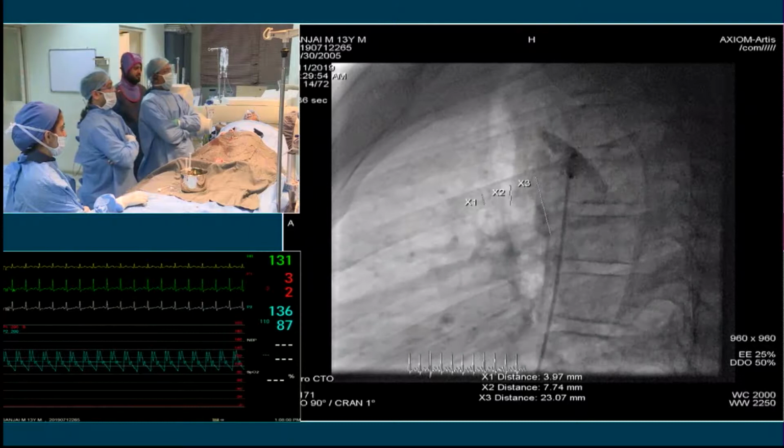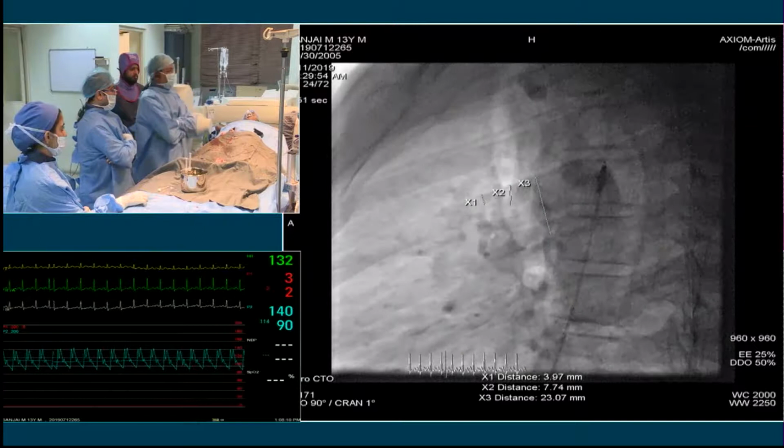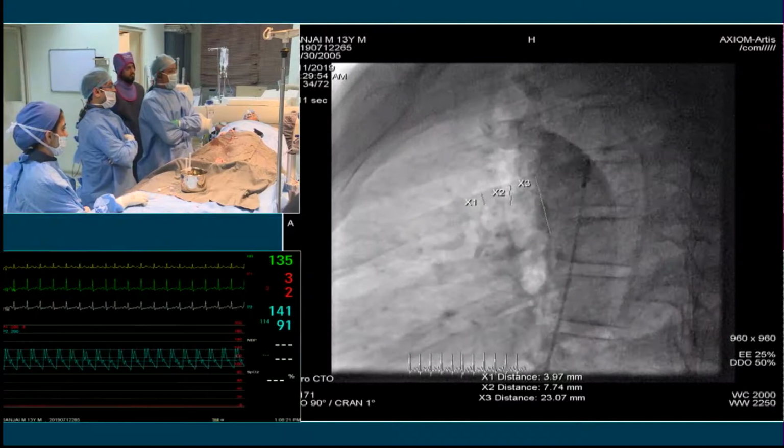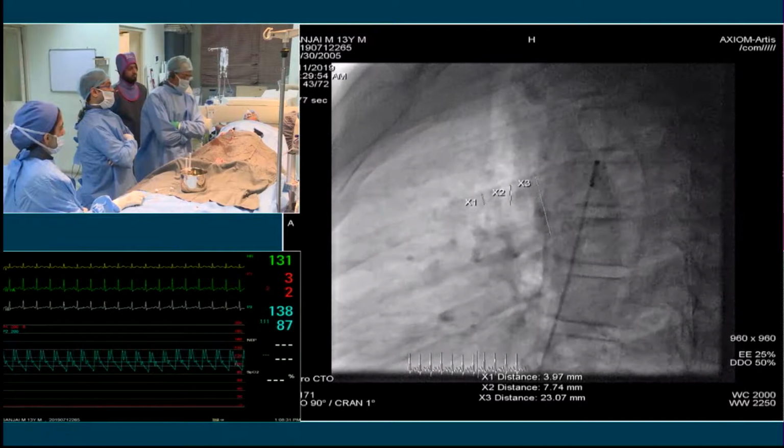I would use 25 or even 30 ml, given at a very high rate, at 1000 psi. We used, of course, 18 ml, 18 flow, 700 psi here, but probably it's not enough. And they're using VisiPaque; probably one of them has less opacification, another reason for the poor quality angio here. Anyhow, if you're interested, I'll go back and do an angio.